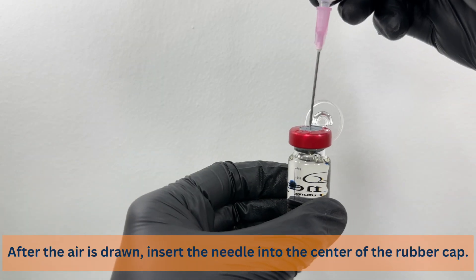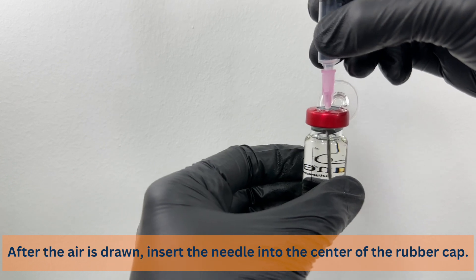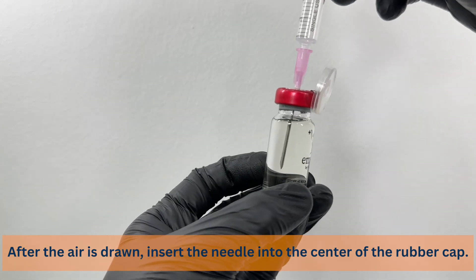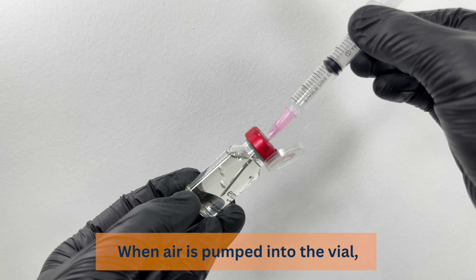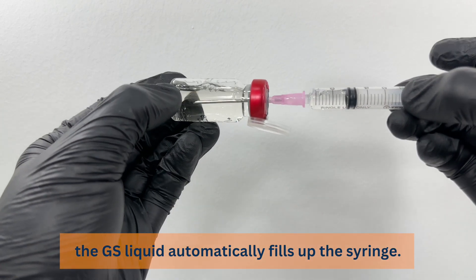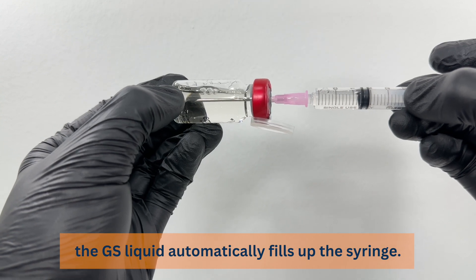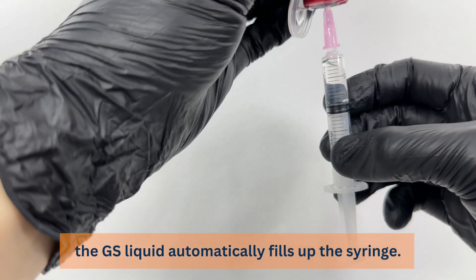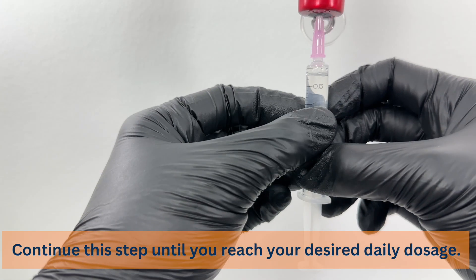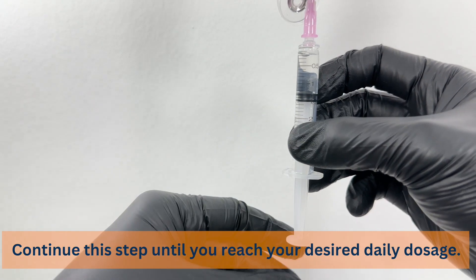After the air is drawn, insert the needle into the center of the rubber cap. When air is pushed into the vial, the liquid automatically fills up the syringe. Continue this step until you reach the desired daily dosage.